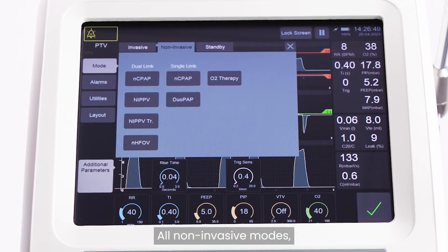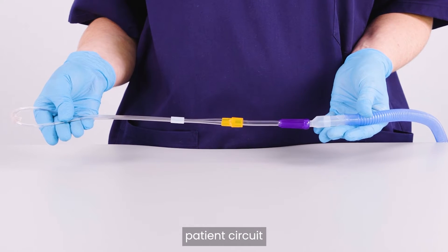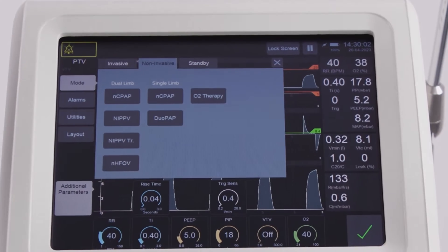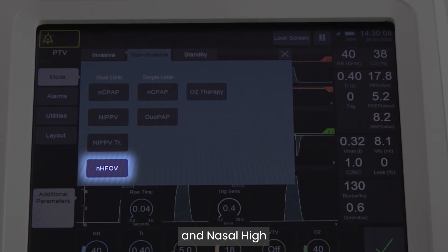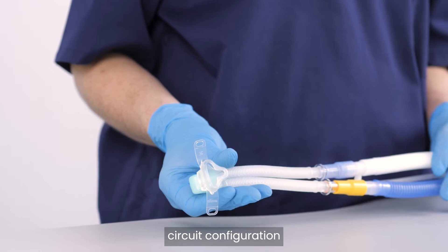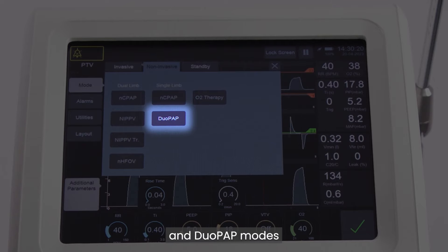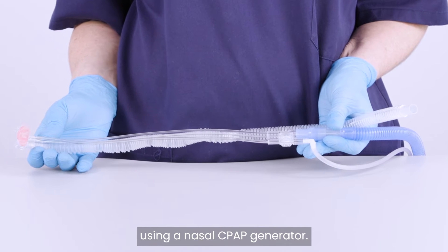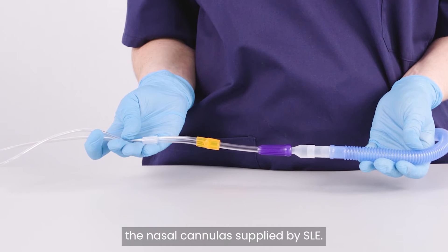All non-invasive modes, including oxygen therapy, can be applied by simply adapting the SLE-6000 patient circuit and using the appropriate patient interface for that mode. Nasal CPAP, NIPPV, triggered NIPPV, and nasal high-frequency oscillatory ventilation can be used with a dual-limb patient circuit configuration using the SLE mini-flow adapter. Nasal CPAP and DUO-PAP modes can be used with a single-limb circuit configuration using a nasal CPAP generator. Oxygen therapy can be used with the nasal cannulas supplied by SLE.